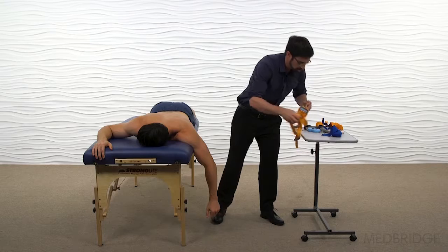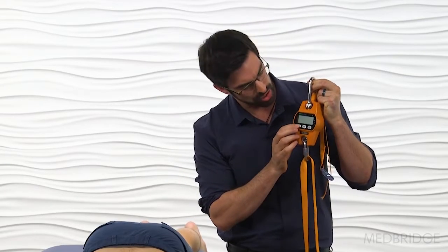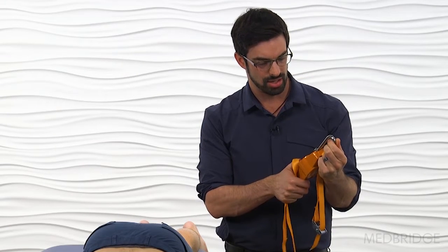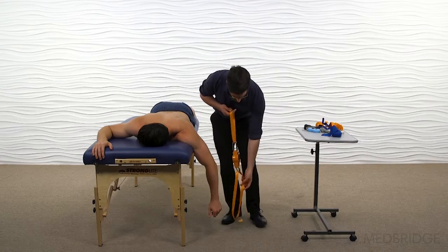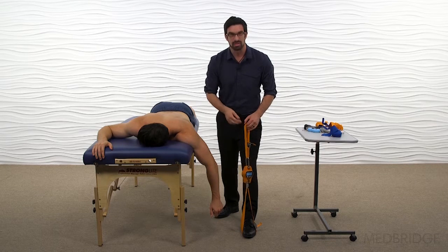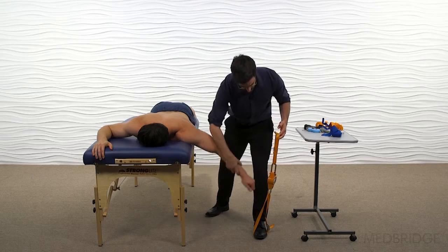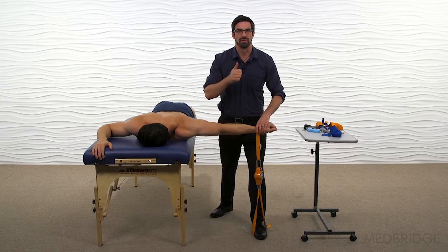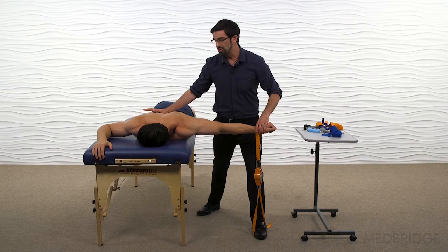Take the dynamometer and first turn it off so it's cleared out, then turn it back on to get zeros on the reading. Tear it, then hold the unit so it's ready to test. I'm going to attach one end underneath my foot, and the other strap goes right through the distal aspect of Aaron's radius and ulna. Put Aaron in the pre-testing position, slide his hand through the device, and position myself so I have a vertical pull. Come in and provide stabilization to the humerus or thorax as needed.